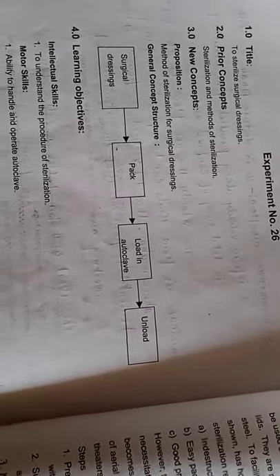Hello students, this is experiment number 26 to sterilize the surgical dressings. Surgical dressings — we have already studied these in theory.